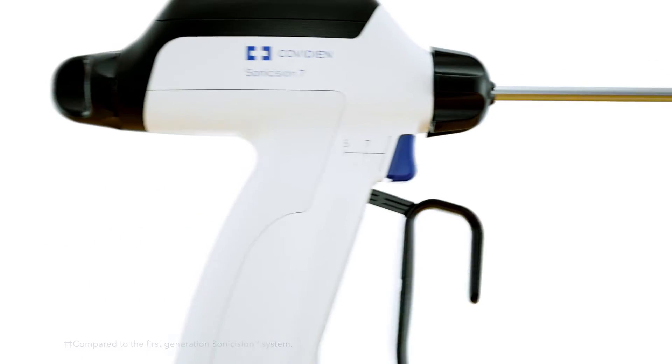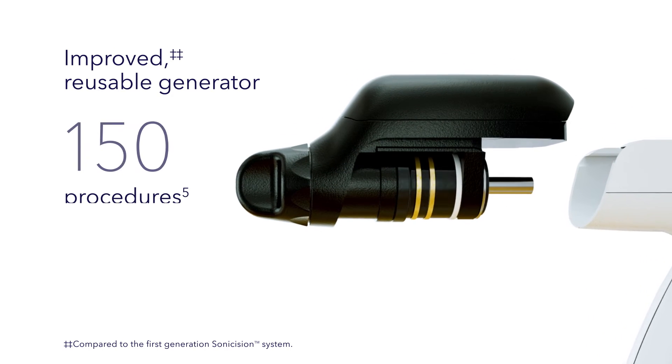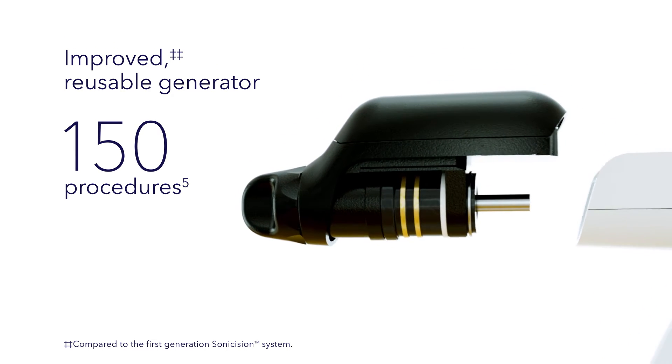The Sonocision 7 curved jaw system has an improved reusable generator that is now autoclavable and works for 150 procedures before you need to replace it.